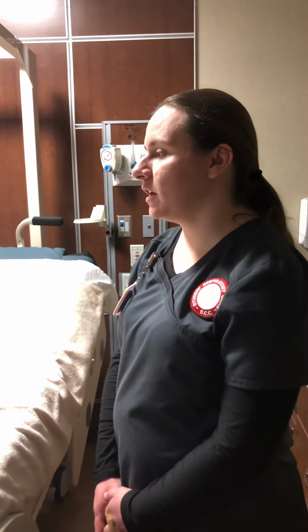and date of birth, and then I will wash my hands, apply the appropriate PPE, and then I would assess the patient, listen to their lung sounds, and then get their vital signs down before the treatment, and then explain to them what an EZ PAP is and what it will be doing for them.